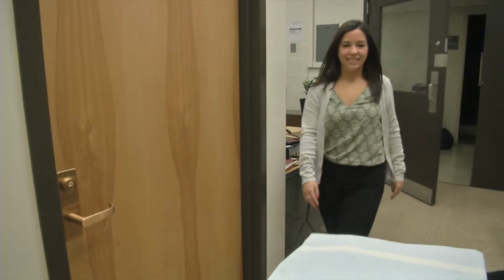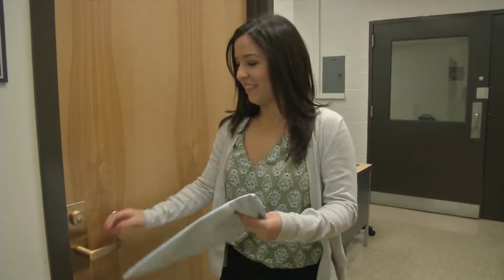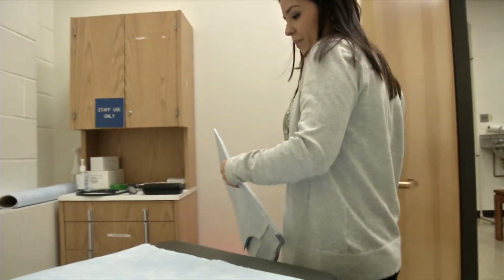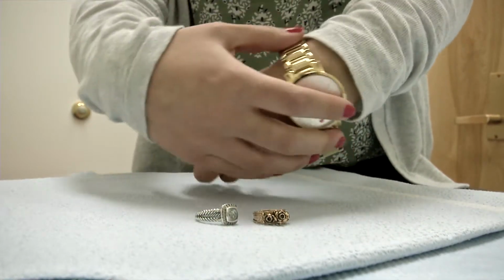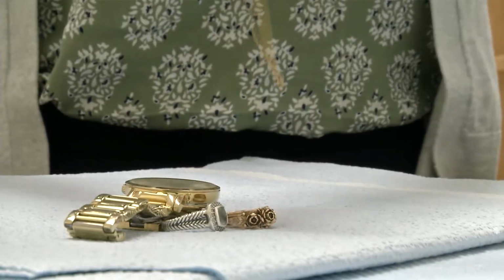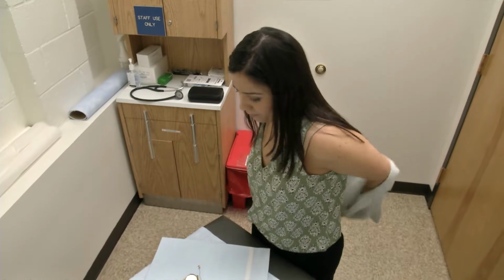There's essentially no preparation except maybe letting us know what kind of metal or electronics you might have in your body. If you have something implanted, it's important that you find out the make and model of that implant so that we can look it up and make sure that it's MRI safe. Once you get to the MRI check-in area, we'll ask you to take all electronics and metal out of your pockets. Anything that can be removed should be removed, and we'll change you into a hospital gown for the duration of the scan.